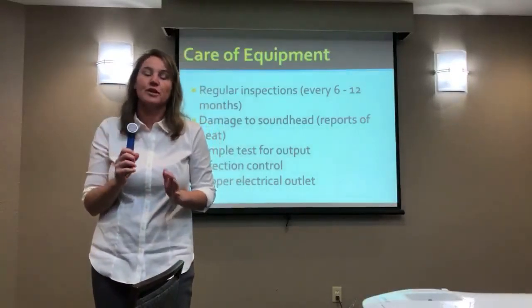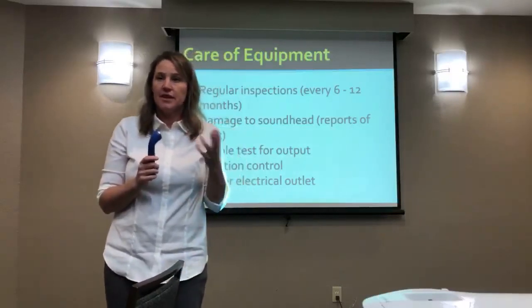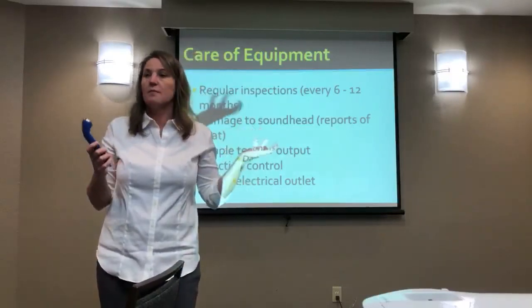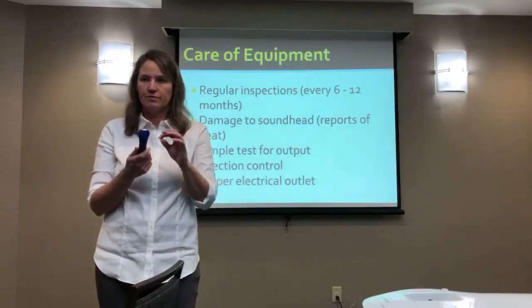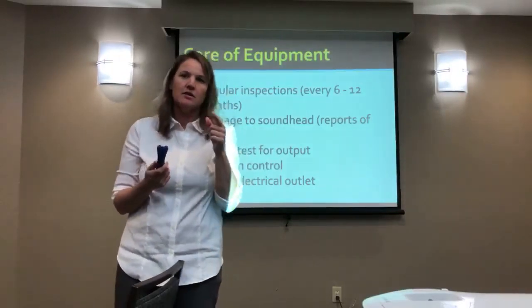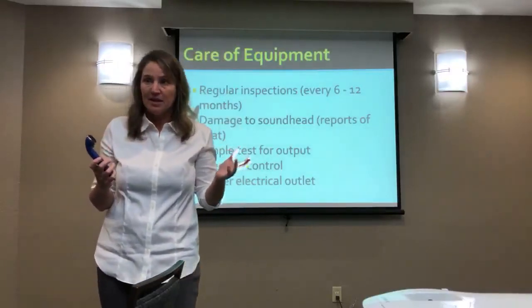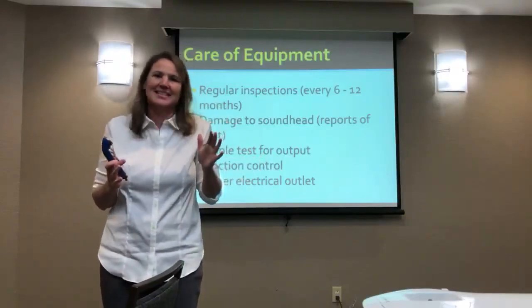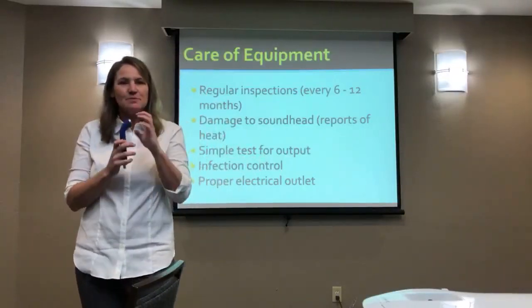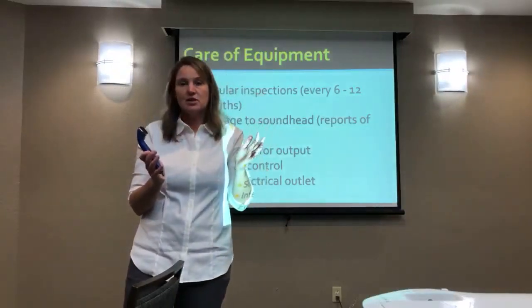That is absolutely true. There are manufacturers though, there are machines now that they will tell you won't come on until you're in contact, and the great ones back there, they say you can lift up and it'll go off. Am I going to lift up and let it go off? No. I was trained, it's too deeply ingrained in my head that you cannot do that. Exposing the crystal to air is something you shouldn't be doing.